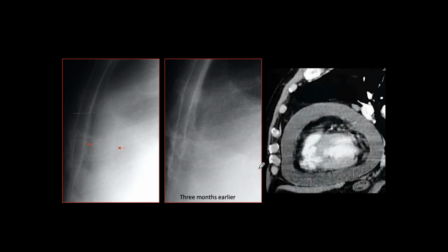And then you have a CT. You can see beautifully how the pericardium is thickened because of the accumulation of fluid. You see the heart, the myocardium finishes here. This is the epicardial fat, the fat on top of the myocardium, and this is the mediastinal fat. This is an excellent sign, very accurate. If you see it, it's a very accurate sign for pericarditis, and that's what this patient had.